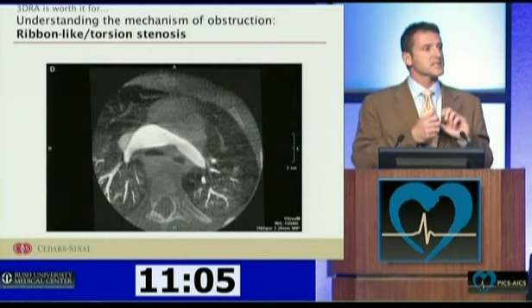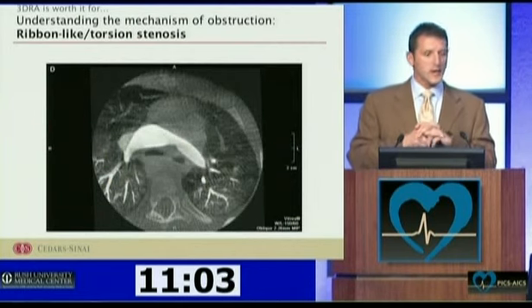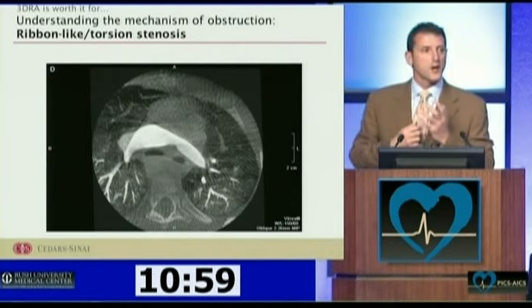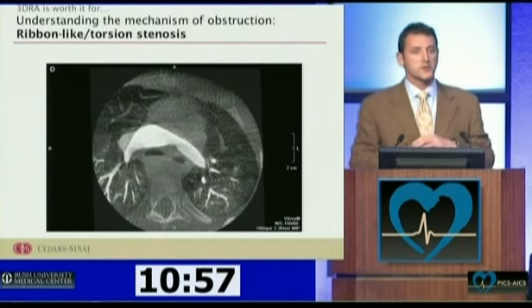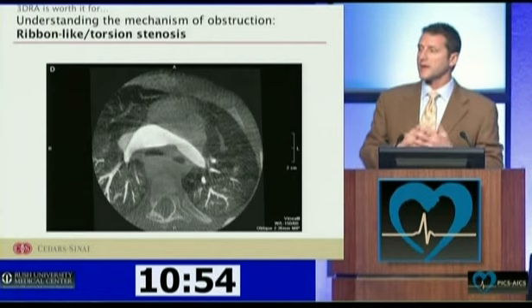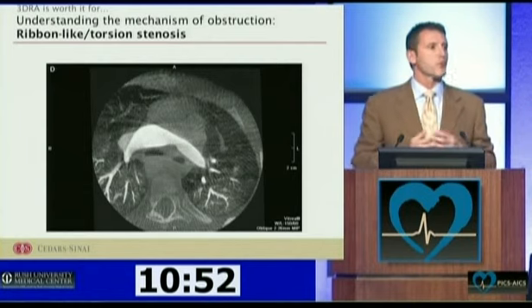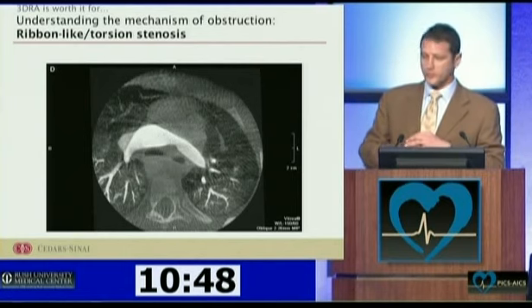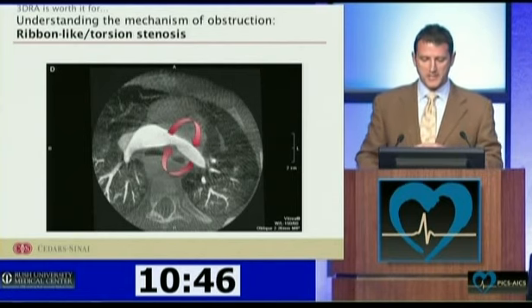And when you take the CT cuts of that and you can thin them out, you can clearly see that this vessel's been twisted. Well, what's the significance of that? Well, one, it's real good follow-up for our surgical colleagues. Two, I see that now, and I don't think angioplasty has any role here in treating this because I can't figure out how an angioplasty would straighten out a torsion, so that patient goes right to stenting.